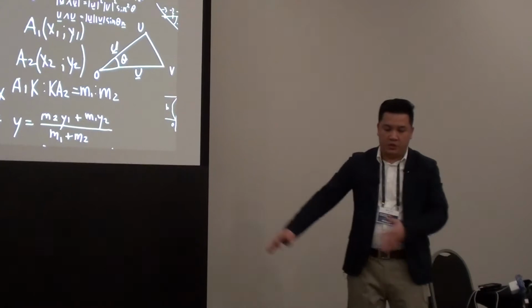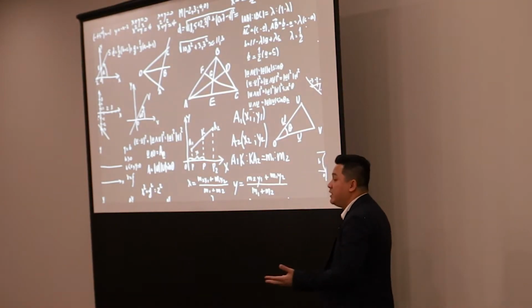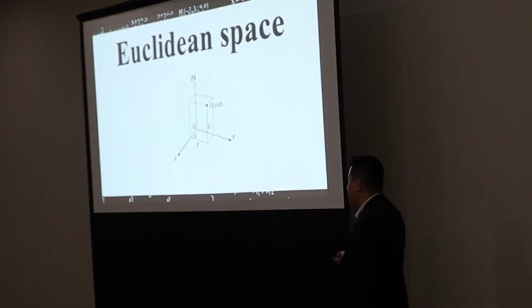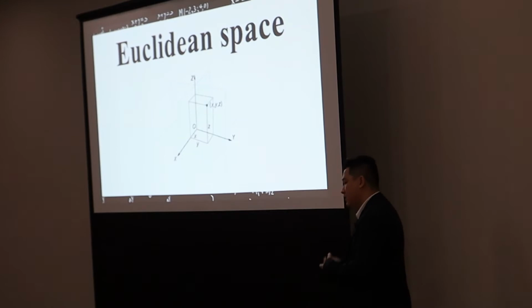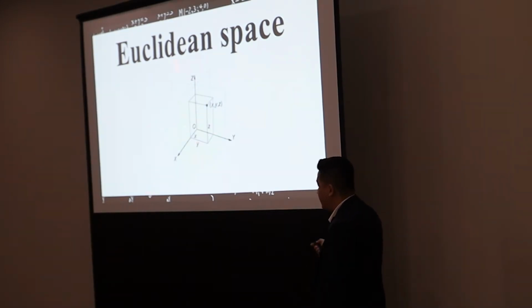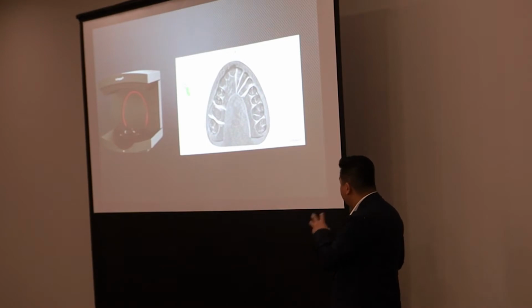Let's move on next to another fundamental subject, and that's geometry and 3D Euclidean space. Very often you see these in programs, the XYZ symbol, an axis or an origin, and it denotes how you map things in 3D Euclidean space. Our CAD/CAM programs use it, CNC machines use XYZ coordinates in Euclidean space to map these things out. 3D printers, same thing. And when you're scanning something, the scanner is taking a bunch of little tiny dots.